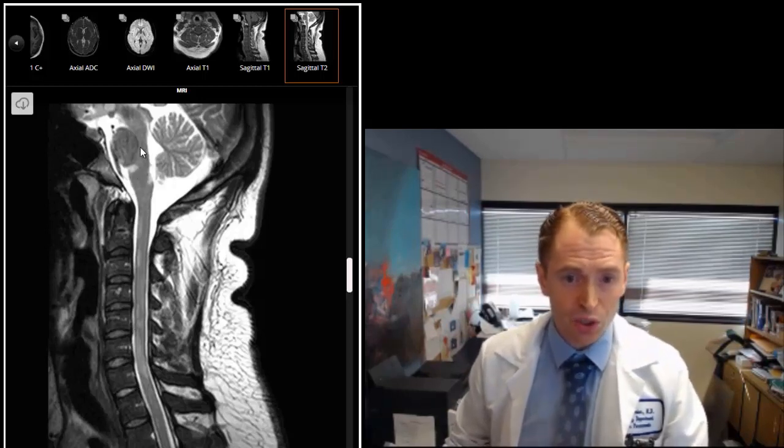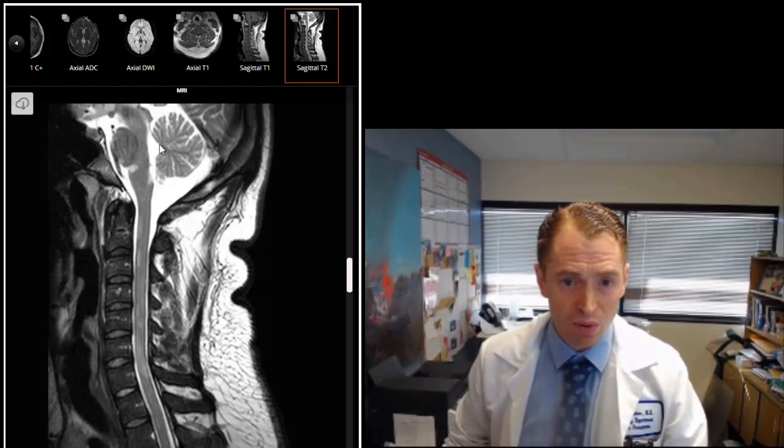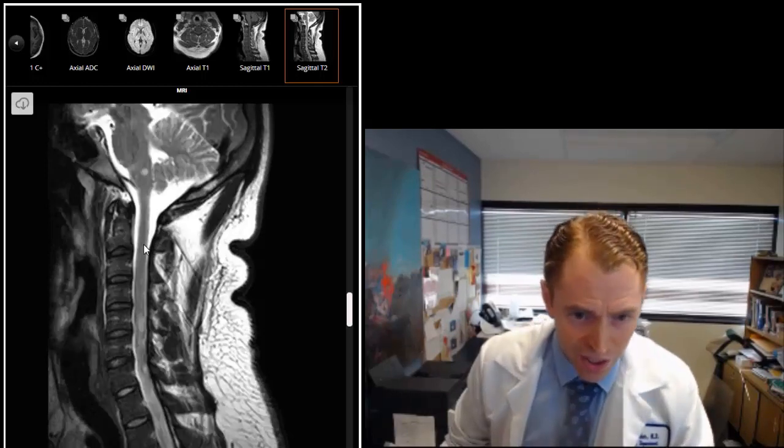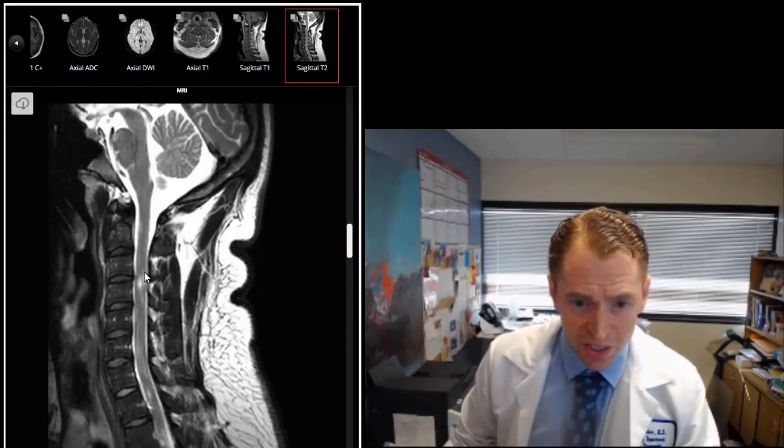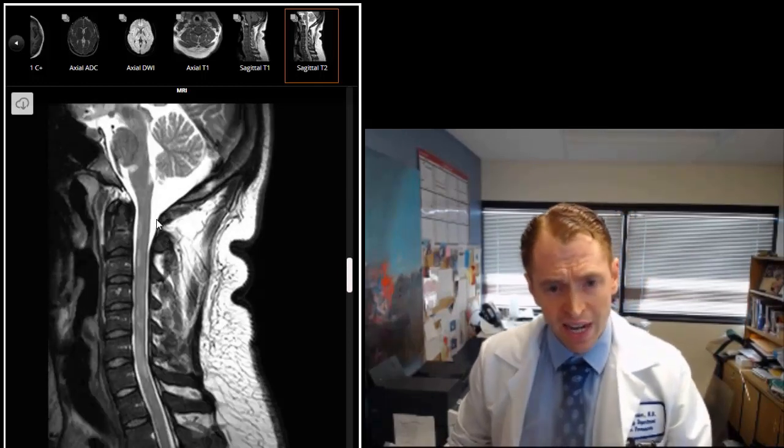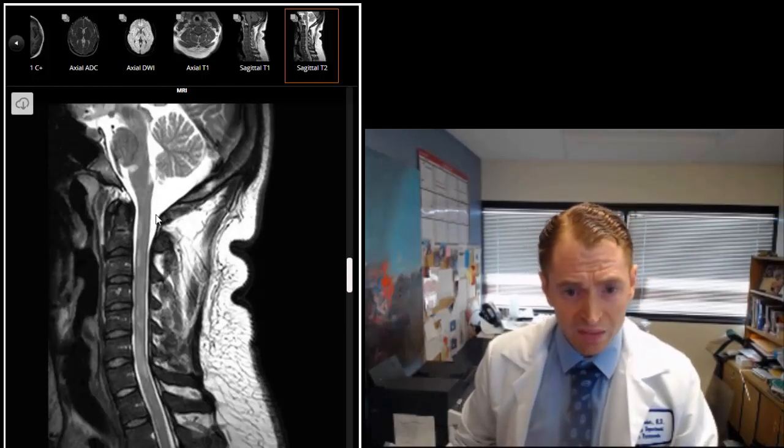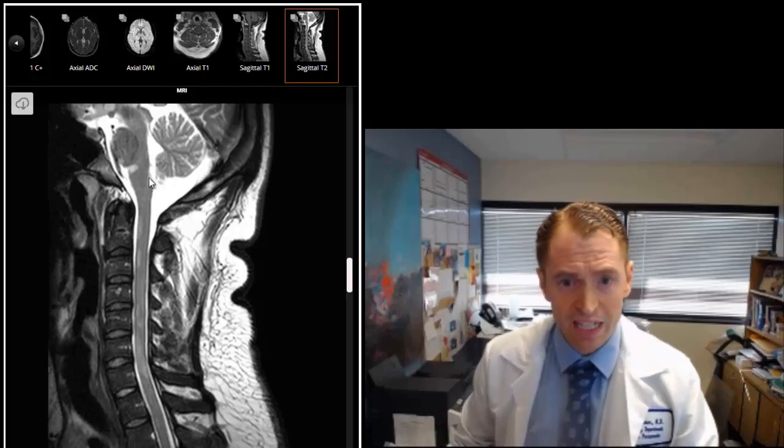You can see the medulla and the pons and the midbrain and the cerebellum. You can see these sort of short lesions that are scattered in different areas. In multiple sclerosis they tend to be mostly towards the back of the cord, but they can also be in different aspects of the cord.